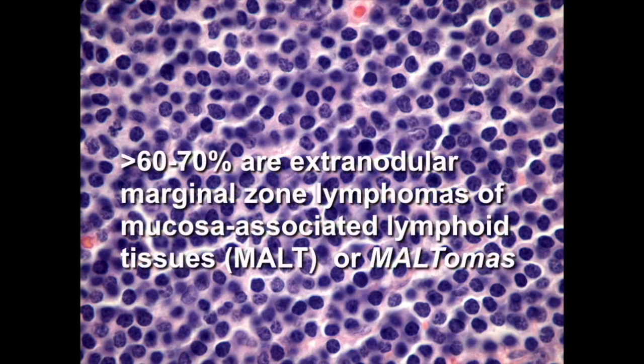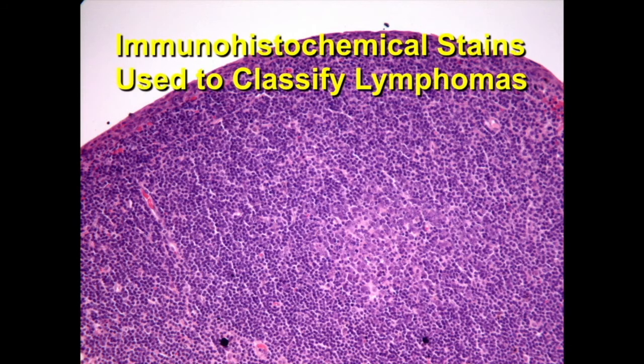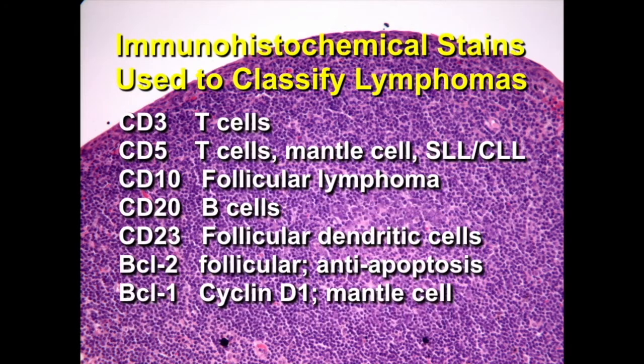We said before, 60 to 70% are extranodal marginal zone lymphomas of mucosa-associated lymphoid tissues. The immunohistochemical stains we typically use to classify lymphomas include the CD3 stain for T cells. The CD5 stain is also for T cells, but it does stain mantle cell lymphomas and small lymphocytic lymphoma as well. CD10 is the stain for follicular lymphoma. CD20 stains pretty much all of them, because they're all B-cell lymphomas. And CD20 is the B-cell marker.